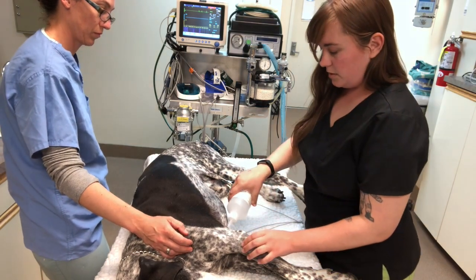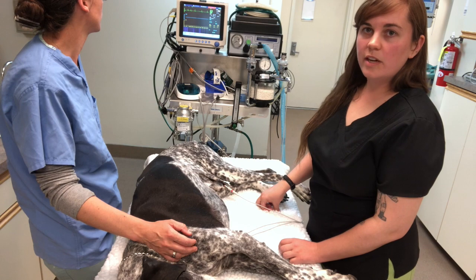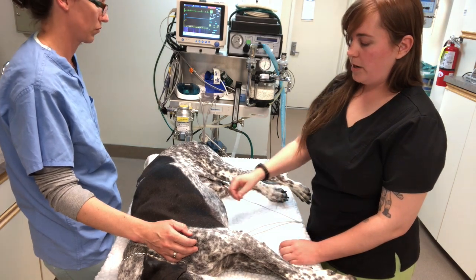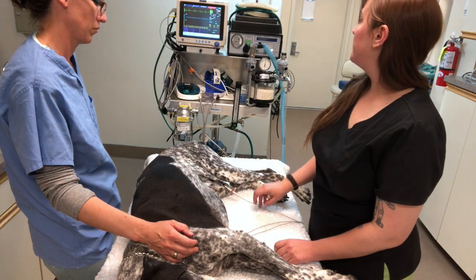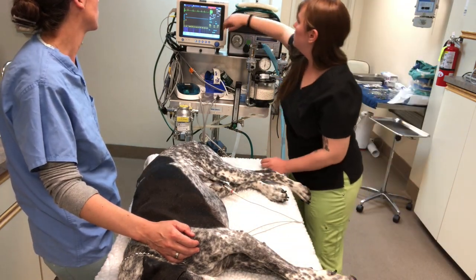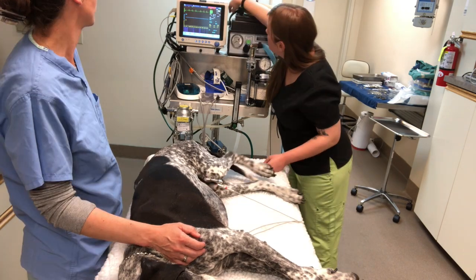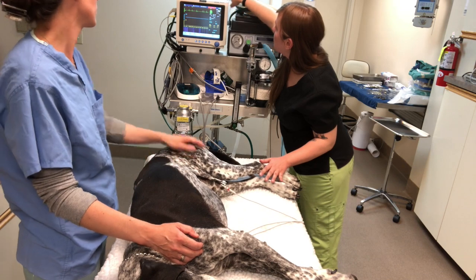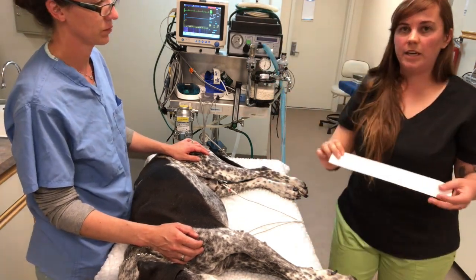We'll wet it with some alcohol. Any artifacts, we can minimize those by moving our leads distally down his arm to combat that. So once we get a decent reading on Austin's EKG, we can print it, so we can evaluate this.